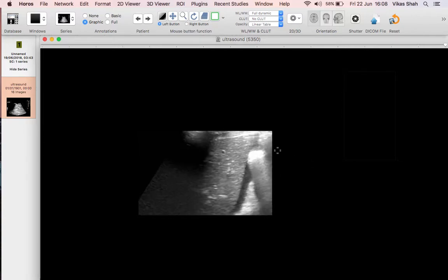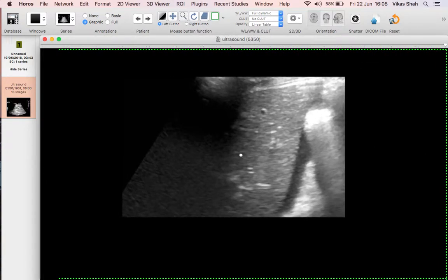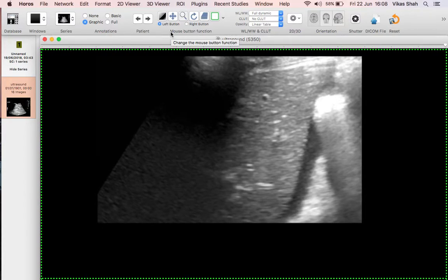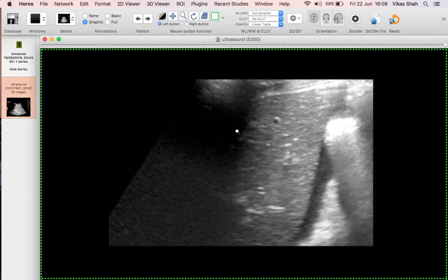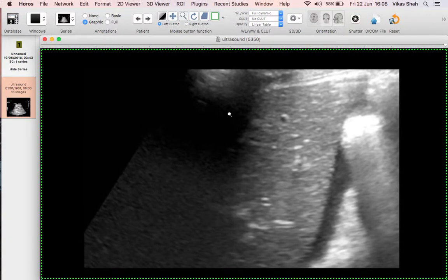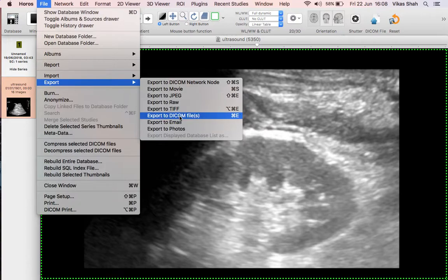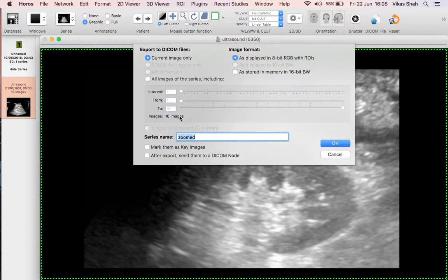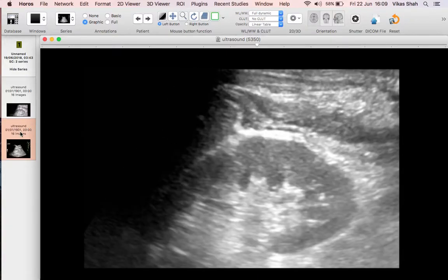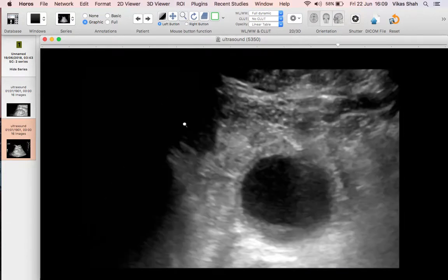As these images stand, they're very small and don't really make best use of the screen real estate. So we should bring them to the centre and zoom them up. The green dotted line indicates your screen area and we can make them bigger. Now we're going to export these images — go to File, Export, and Export to DICOM files. Here you can choose to export the current image or all of the images. Select all, call it 'ultrasound', and click OK. It creates a brand new series with all of the images zoomed up.